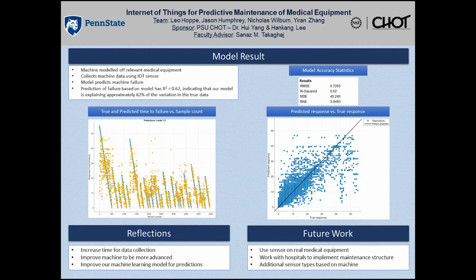Looking towards the future, we would hope that this sensor and predictive maintenance model could be implemented into real medical equipment for longer periods of time to collect data. And also, we would want to diversify our sensors so that they are fitting for the machine.